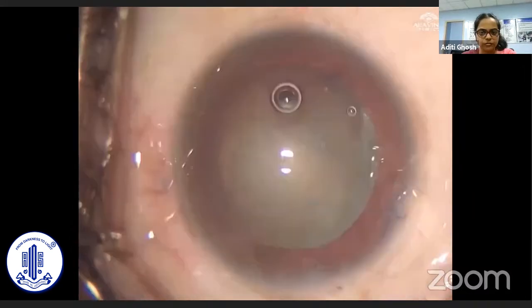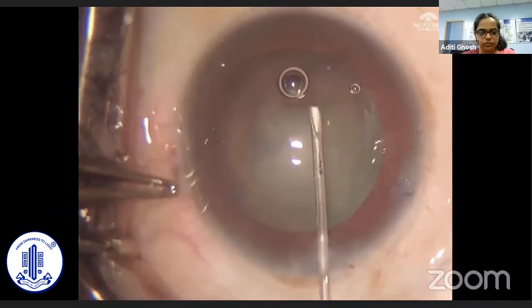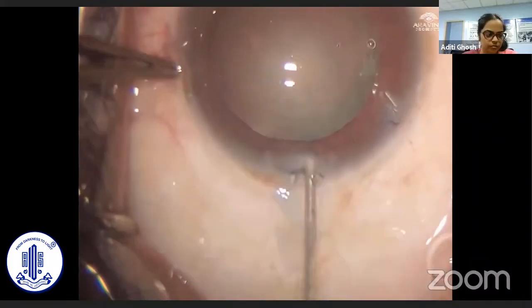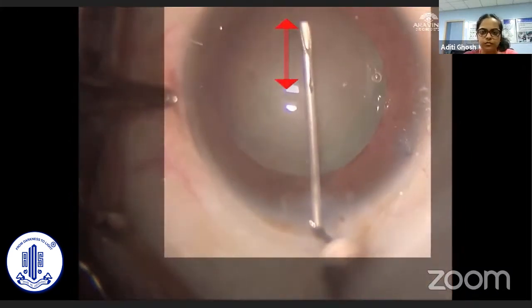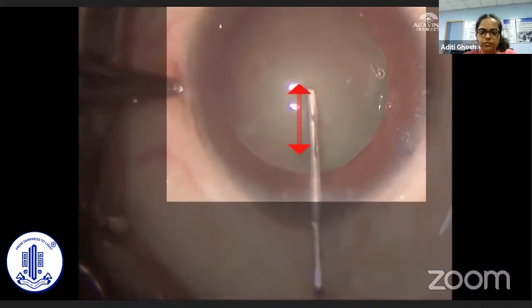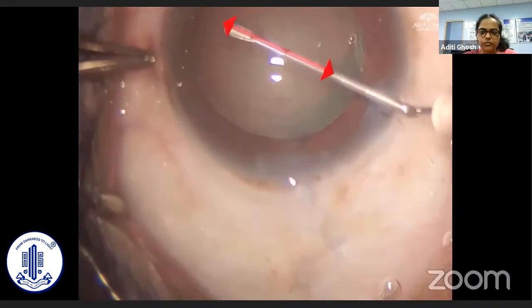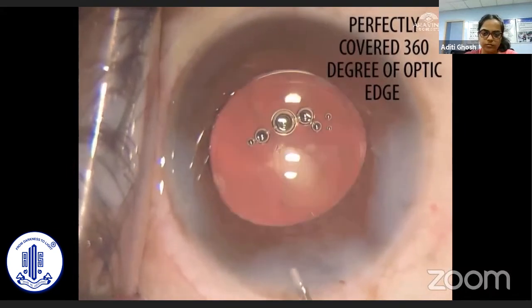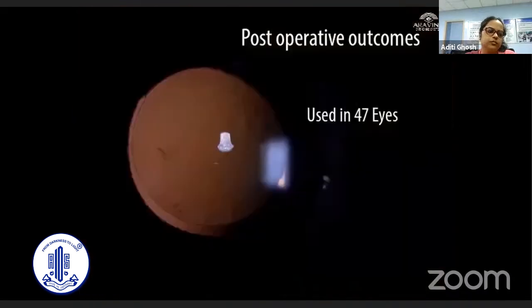Here, a continuous curvilinear capsulorrhexis has been completed in a uniform manner. The rhexis radius is confirmed by the cystitome used in all clock hours with the dents as the scale. A double-dented cystitome can also be used to confirm the final adequate diameter of the rhexis. At the end of surgery, a 360-degree overlap of the optic edge of the intraocular lens is achieved.